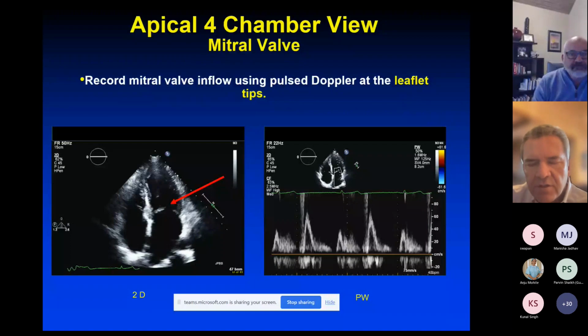And so we would like you to record mitral inflow velocities with both pulse wave and color flow, and continuous wave Doppler imaging. And so when you obtain the assessment of mitral inflow using pulse wave Doppler, please place, and you can see this on the image on the left, please place the interrogation sector at the tip of the mitral valve leaflets, and that should display the image to the right, which is a nice clean inflow velocity profile for mitral inflow.